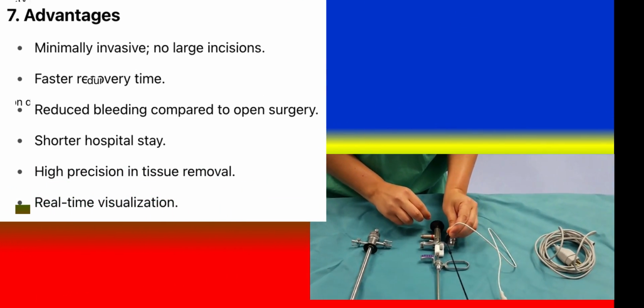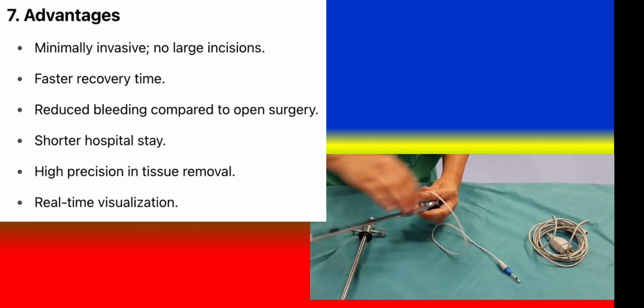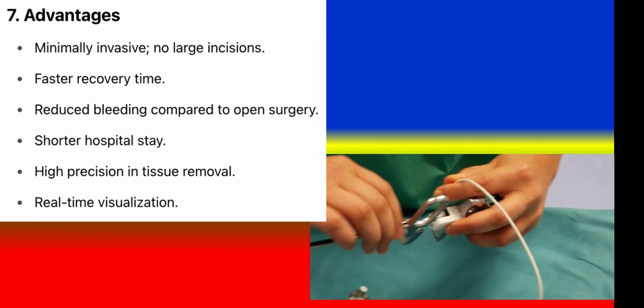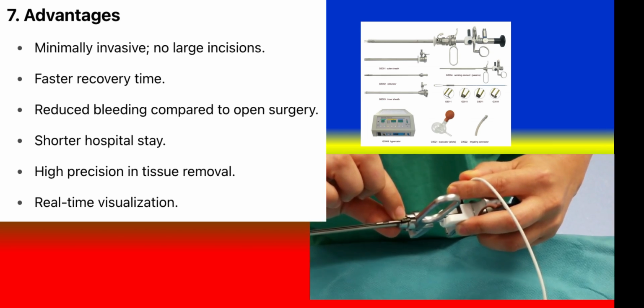7. Advantages: minimally invasive, no large incisions, faster recovery time, reduced bleeding compared to open surgery, shorter hospital stay, high precision in tissue removal, real-time visualization.